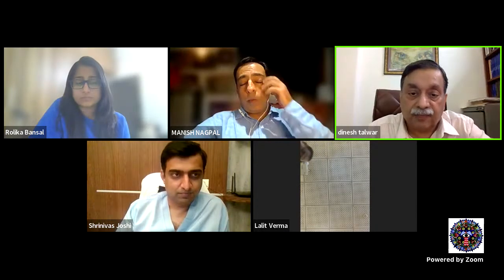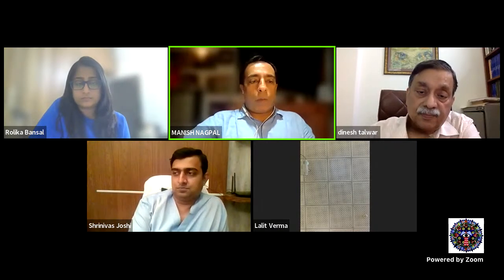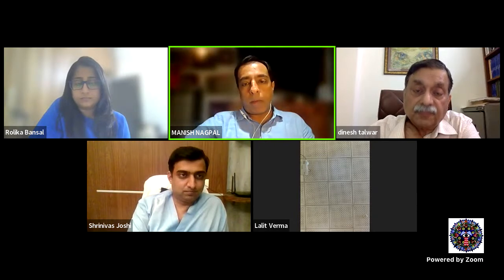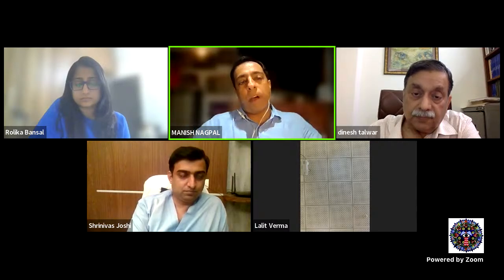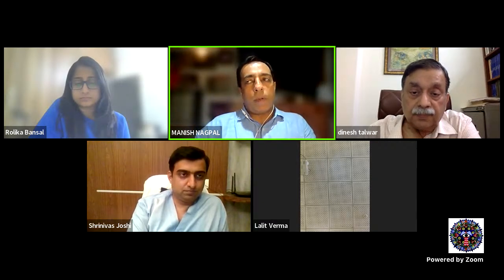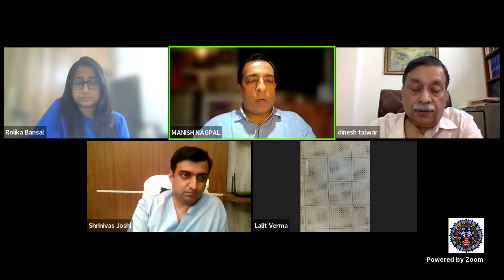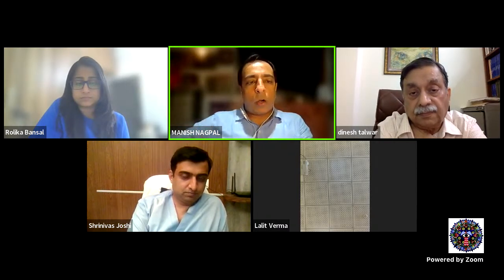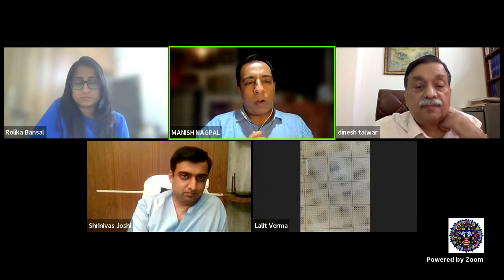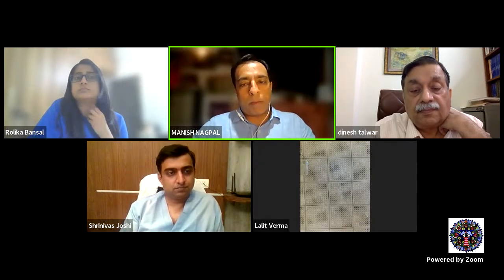Yeah. So I think the one thing I again want to stress, I've already shown it on all my cases, that I use PFCL for almost 90% of my cases, even primary detachments, simpler ones. I feel that it makes a lot of passive flattening possible, which is less traumatic than anything else you might do. Except for those very simple cases where the bulla comes up and you do an endo drainage, it comes down. But if there's anything beyond that, if I feel that the fluid is short of the break, I would not just go ahead and make a retinotomy for that reason. I would rather put PFCL, shift the fluid to the periphery, and then drain from the pre-existing break.